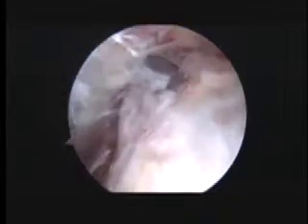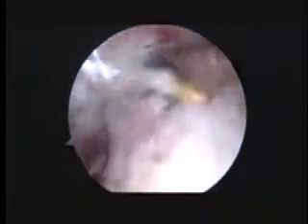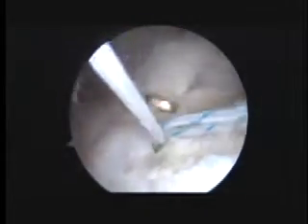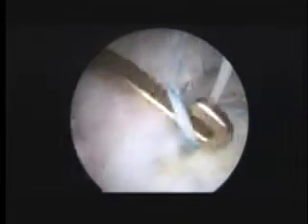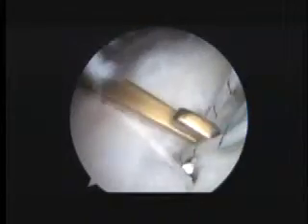Turn to the right next. Sorry. We'll pull tight. We'll look over here. Okay. And it looks like you at least want to take it that way. Is it still wrapped around? Pull tight on this. That looks pretty good. So we'll take that out of the way. Black's next. Looks like the black one's next, so we'll take this one this way. And then we'll even take the blue one out this way.